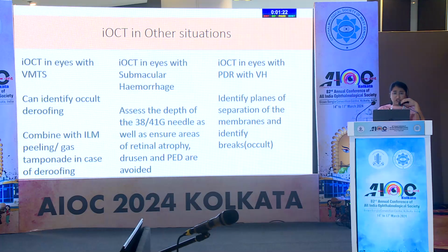IOCT in other situations would be in vitreomacular traction syndrome. Our most horrifying complication would be if the deroofing of the cyst occurs and a macular hole forms. So in these cases, an intra-op IOCT would confirm this, if it's present or not, and further help in deciding the management in these cases.